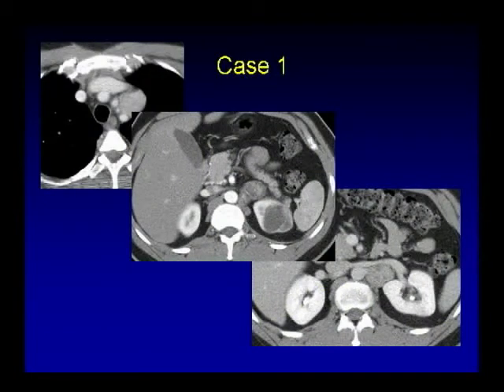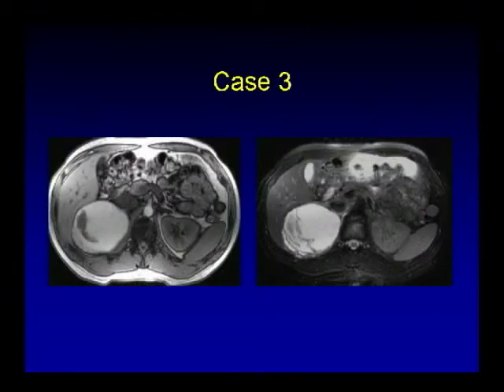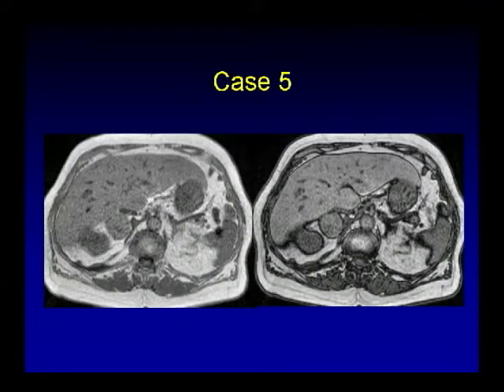First are your five unknown cases: case number one, case number two, number three, number four, and number five. This is a gradient echo in and out of phase, and I want you to focus on the right adrenal gland.